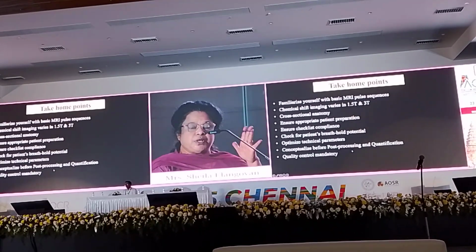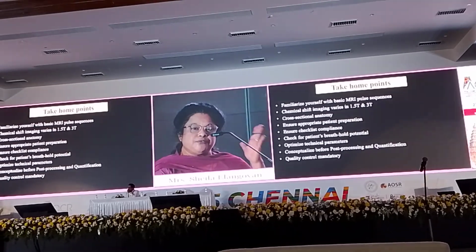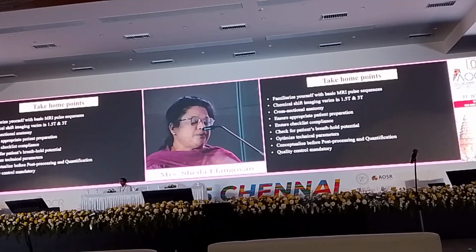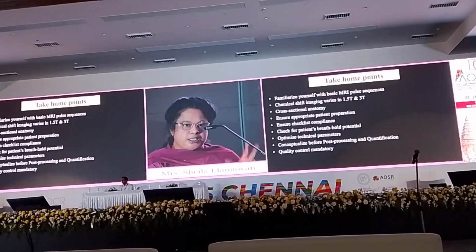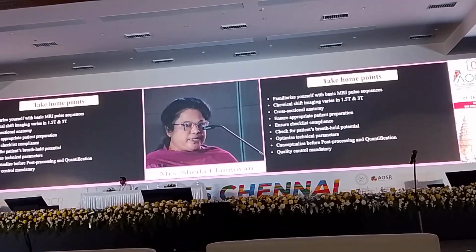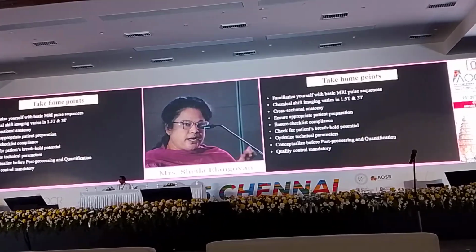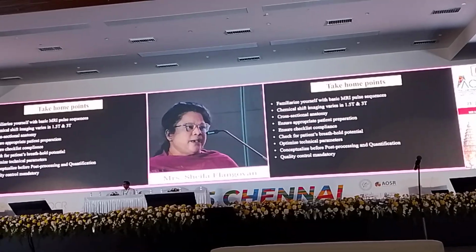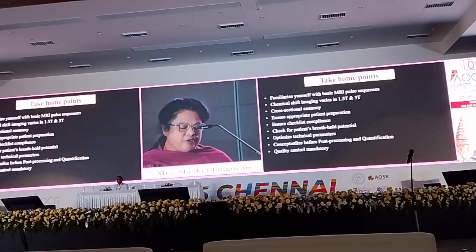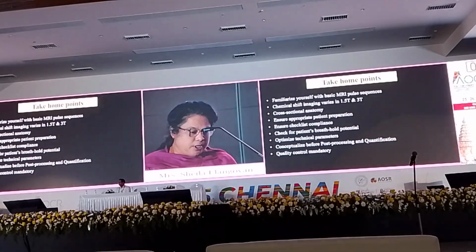Now, if you ask me whether you can do an elastogram with or without contrast, iron and fat quantification has to be done before contrast. But for elastogram, the literature says GBCA does not influence the measurements. But last week, one of our students tried a couple of sequences with and without contrast, and he says there are slight changes in the wave image and in the measurements. So I think that is still under debate. We need to really evaluate that.